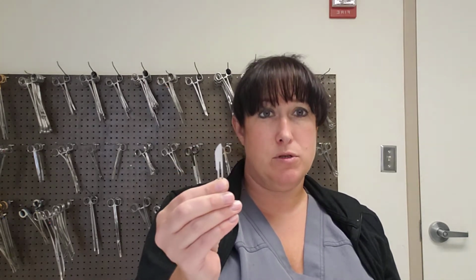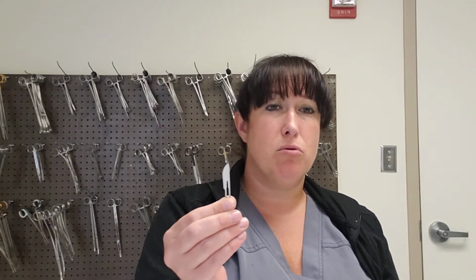And your second component is going to be this scalpel blade. There are different ones out there, just like there are different scalpel handles, and this is disposable. So at the end of the procedure, it's really important that it's removed from the scalpel handle and put in the appropriate sharps container. It's also considered accountable. So before and at the end of each case, and in between, there's going to be some counting done too. You're going to count these as your sharps.